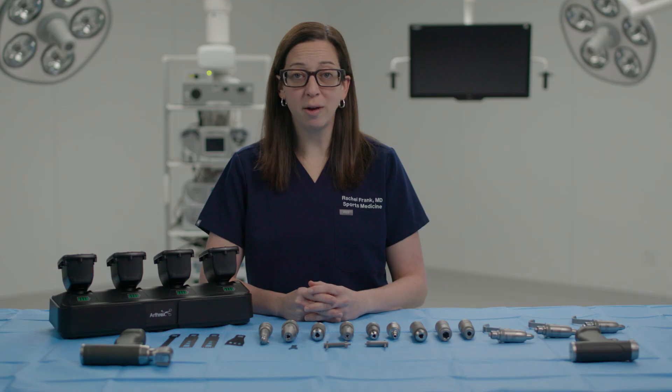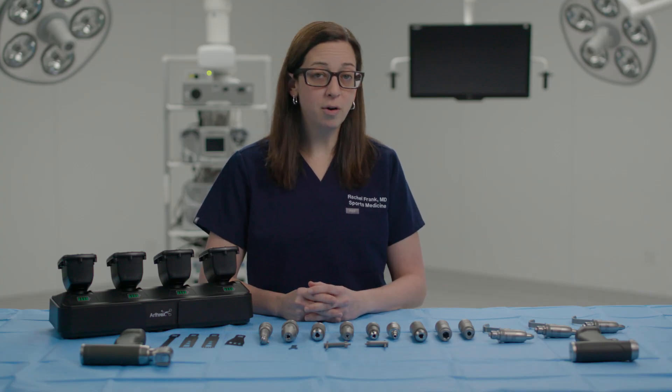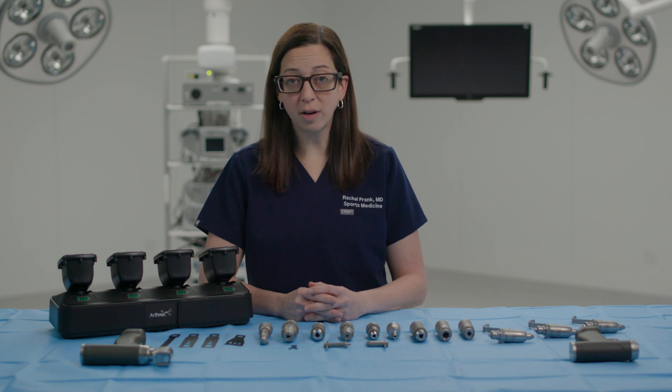There are also two saw attachments — microsagittal and reciprocating — for making smaller cuts, various burr attachments, along with several ream attachments, including a Hudson-modified trinkle reamer. The drill and ream functionalities are built into the attachments, so I don't have to switch between drill and ream modes during a case. In general, I don't have to use as many handpieces when operating.